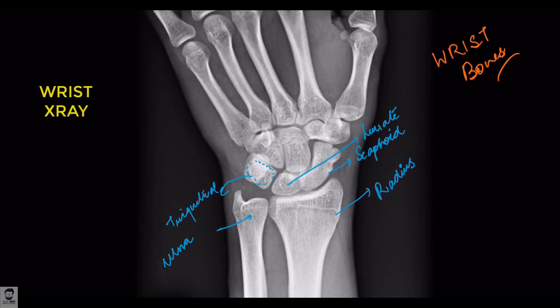As you'll see in a moment, the pisiform kind of overlaps the triquetral bone. So the proximal row is: scaphoid, lunate, triquetral, and pisiform. The solid markings here are for the pisiform bone, which is a very small bone and is the innermost bone on the proximal row on the most medial side.